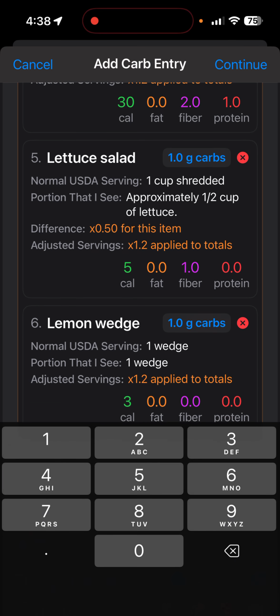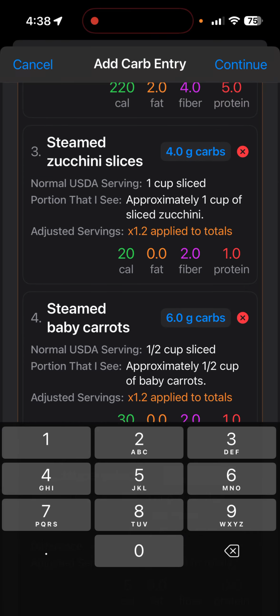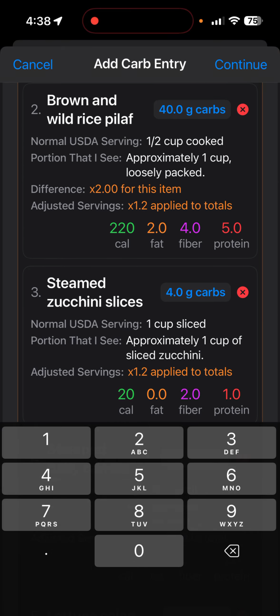And so that's what is really cool about FoodFinder. I feel like this has helped me improve my time in range by at least 10 or 12% over the last year or two since I've been using it. And so I hope you get the same results, and I hope that it will bring you the information that you need to feel more confident in dosing based on what it examines in the picture.